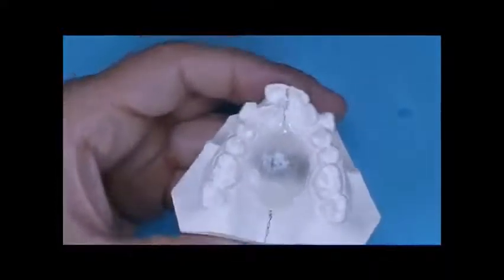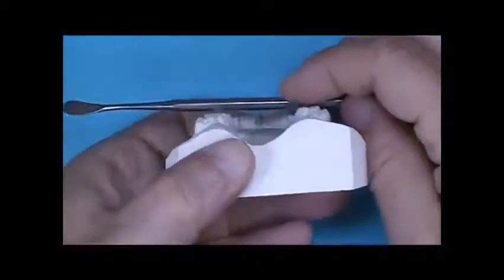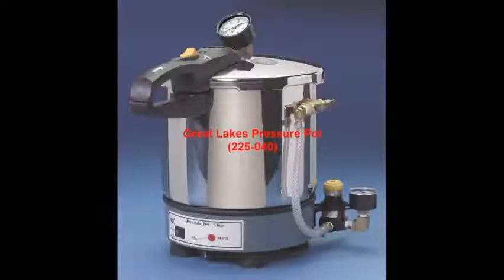Check screw position before curing. Cure the acrylic in a heated Great Lakes pressure pot. Heat and pressure are preset at 120 degrees Fahrenheit and 20 psi. A small amount of water is within the pot but kept below the inside stand height.